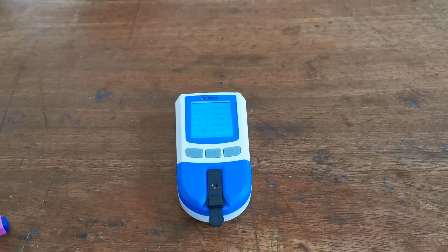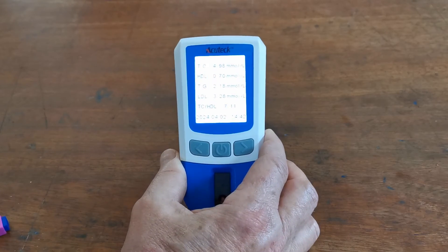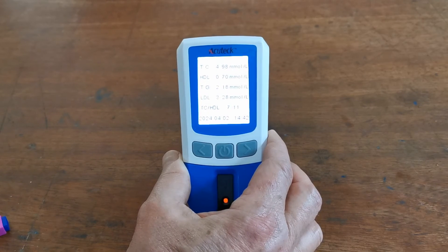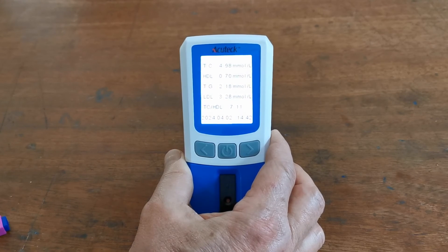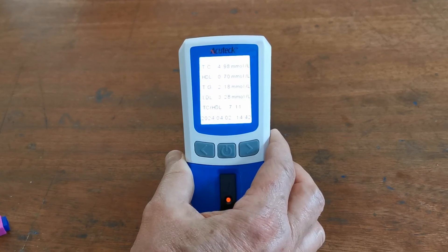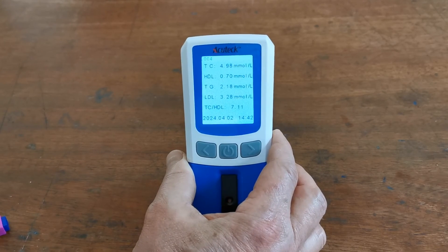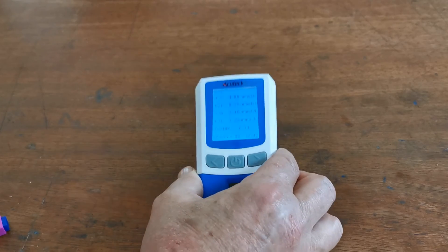The cholesterol readings are now showing. The results are: 4.98 mmol/L total cholesterol, an HDL of 0.7, a triglyceride level of 2.18, an LDL of 3.28, giving a TC to HDL ratio of 7.1. The reading is recorded and time-stamped as 14:42 on the 2nd of April 2024.